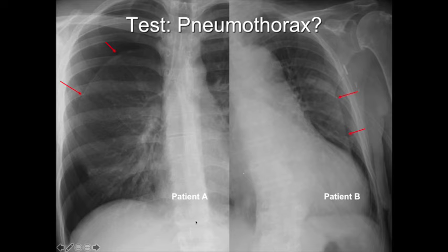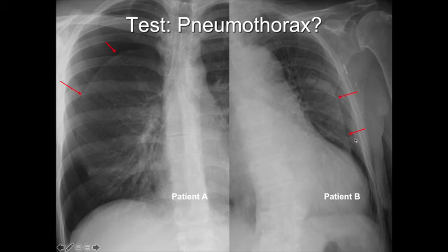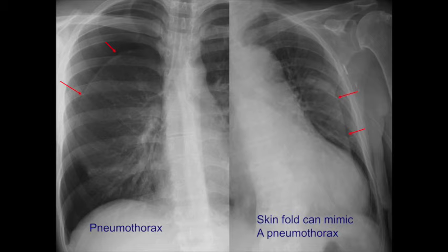Patient A — is this a pneumothorax? Yes it is. You have a pleural line, you have lung markings here, and you have no lung markings peripheral to that line. Patient B — is this a pneumothorax? You have lung markings medially, you have a line, and then peripherally you still have lung markings. This is a skin fold mimicking a pneumothorax — essentially a fold in the patient's soft tissues creating an artificial line.